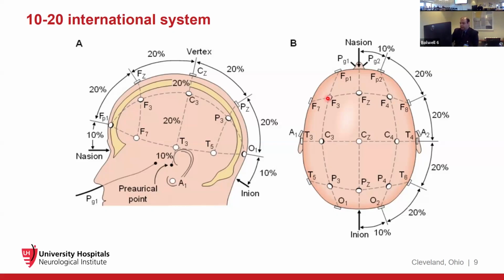And then you have these midline electrodes. This is what sleep people record, mostly from FZ, CZ, PZ. Most of the sleep graphoelements that you're going to see tend to be maximally localized to these midline areas. So as part of many sleep studies, you might not have the full 16 or 18 channel EEG, you might just have 5 channels, and they are usually created by combining these 3 or 4 electrodes in the midline, okay?